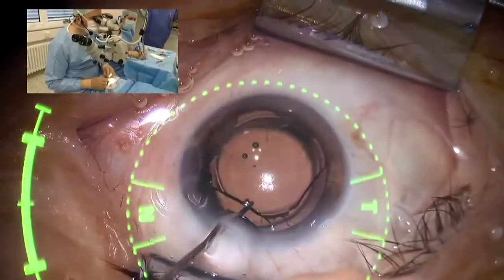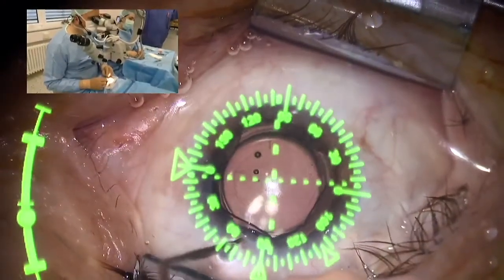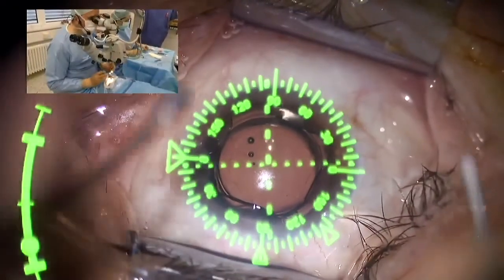Now I'm satisfied. There will be a final check. Probably I will rotate the lens as well.